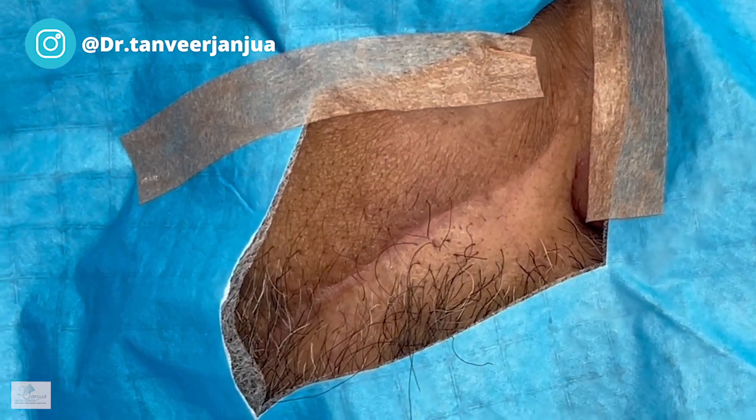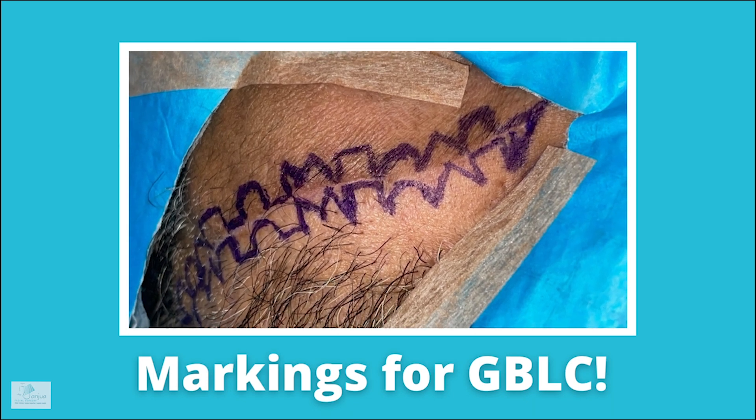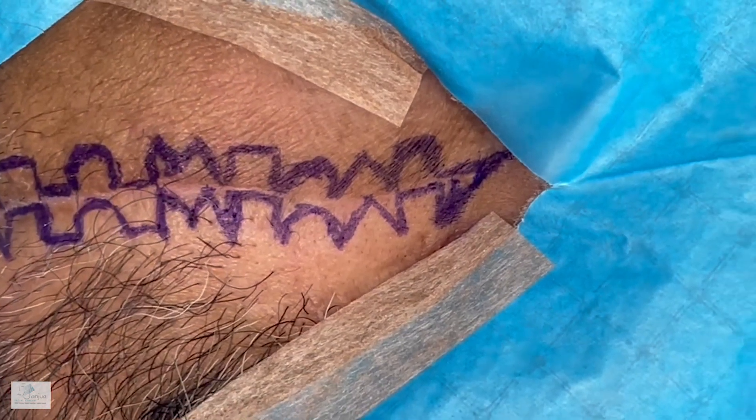We will try our best not to take too much skin because there's already been a loss of skin in that area and we want to preserve it. This goes further down, so we'll shave off some of the area to follow the scar and get it all done. We'll show you once we've done the drawing.